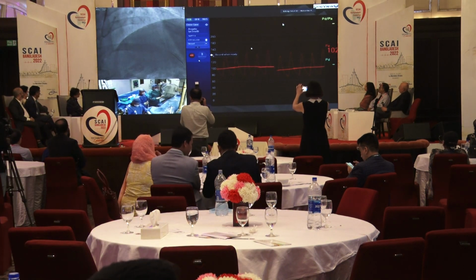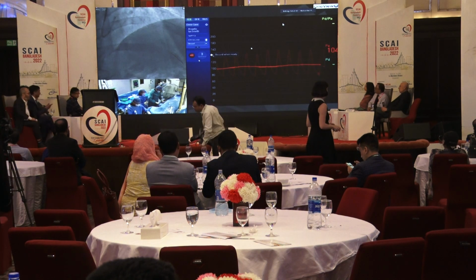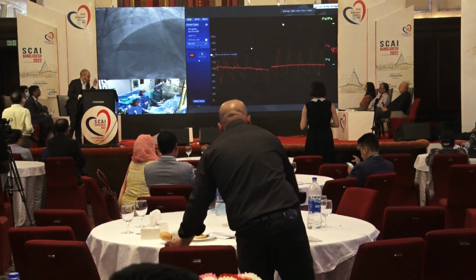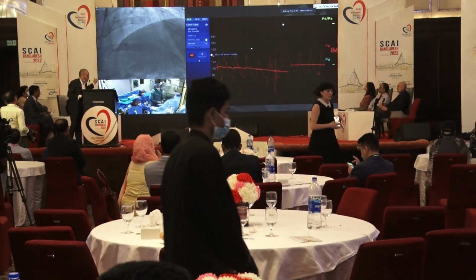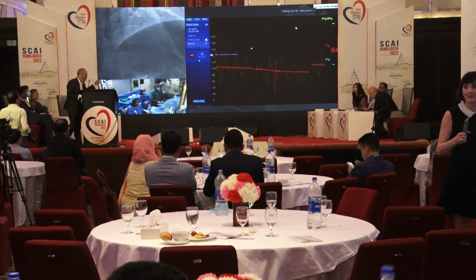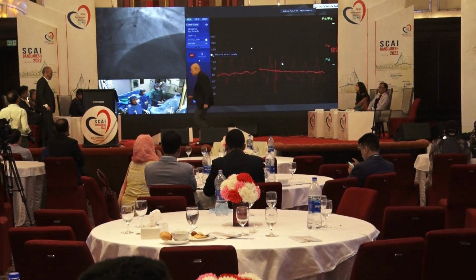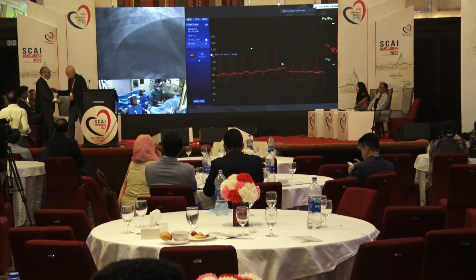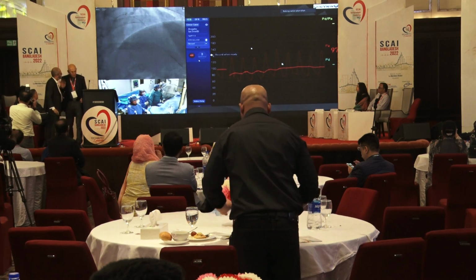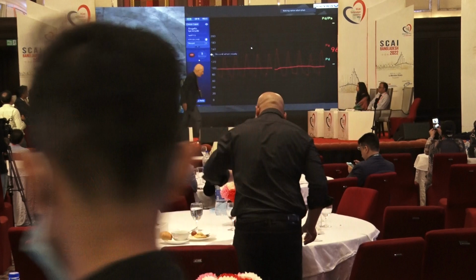So far, what is your impression of this long LAD lesion? What would you recommend? Yeah, I think imaging is very important, Antonio. So let us go and see what the OCT shows, and then we can decide how we approach this, right?